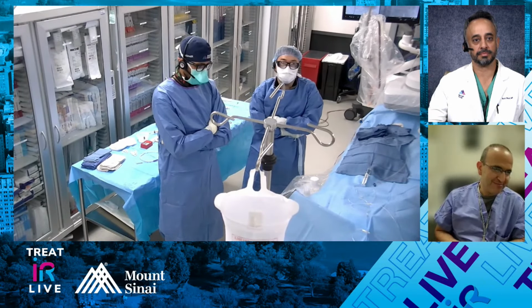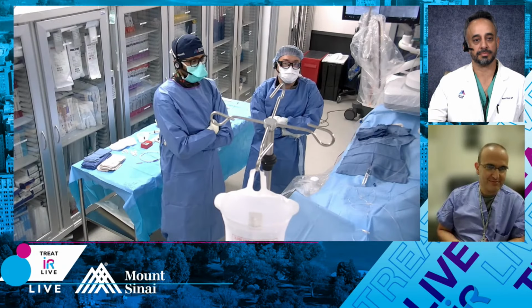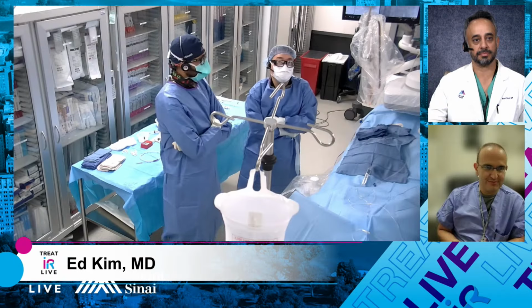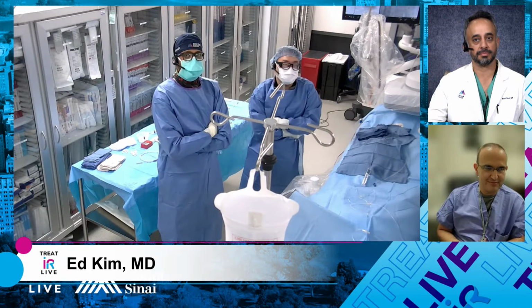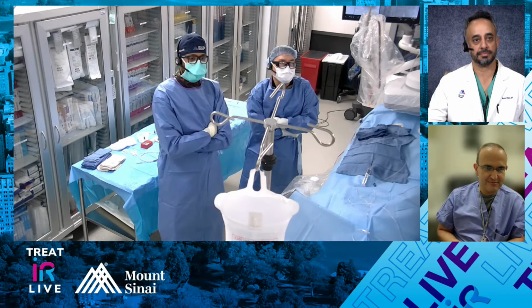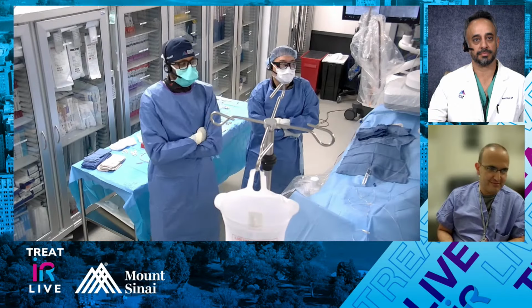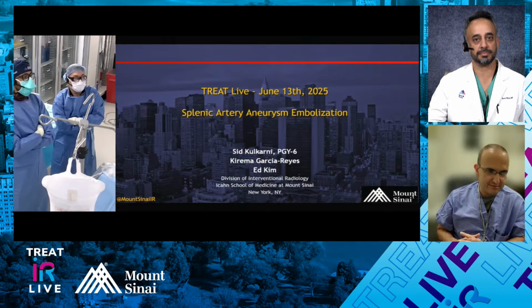So our technologist is Giselle, our nurse assisting us is Krizia, and we have our anesthesiology team here as well. Liz is with us, and our PGY6, Sid, will be presenting the case. Everybody, good morning. My name is Sid Kulkarni. So today we have an interesting case of a splenic artery aneurysm.